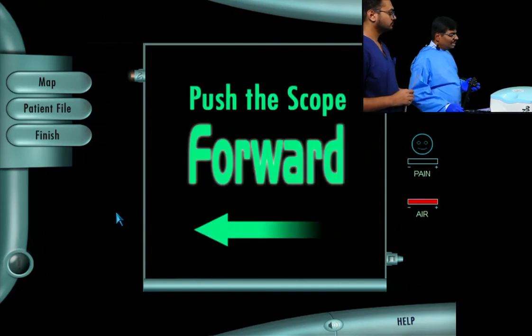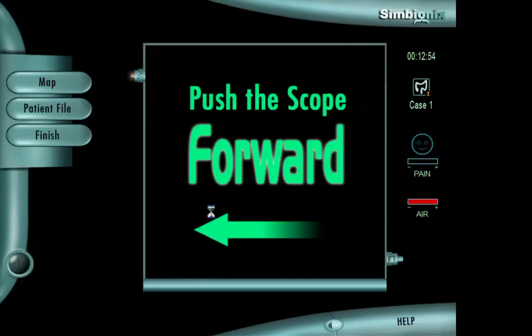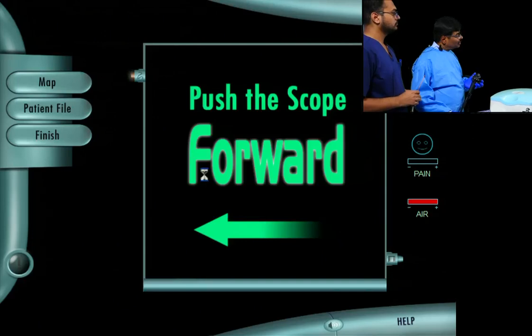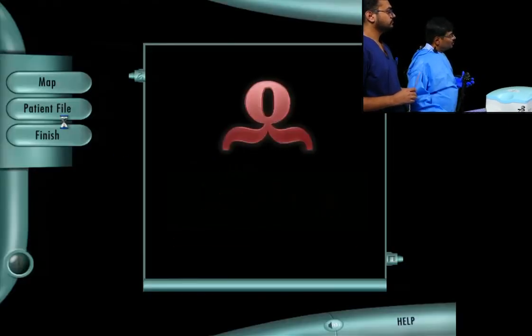So this is in addition a diagnostic module. Let us see the potential of this by giving one more example. There are actually 10 diagnostic and 10 therapeutic modules built into this system, and out of these, at least to give a taste of what you can teach your trainee to learn, is one of the therapeutic modules.